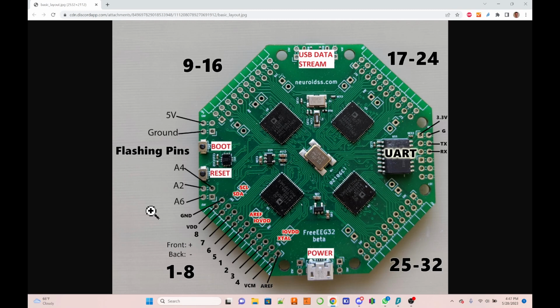Here we have the option whether we want to connect all those negative terminals of all the channels together or not. If you do it, you have to do it physically with a wire. The OpenBCI board has the option of doing that from a single pin out, which is already on the board, and that pin is called SRB2. So SRB2 is a collection of all of the negative terminals of the 8 channels on the Cyton board. And here we don't have that, but you can make it yourself by connecting all of the negative terminals, or you can take a number of negative terminals, connect them, and keep some channels available for different montages.